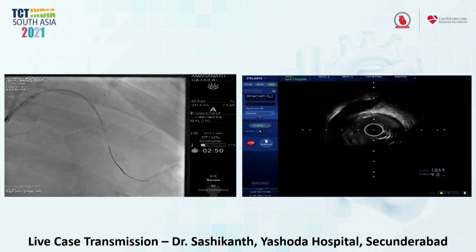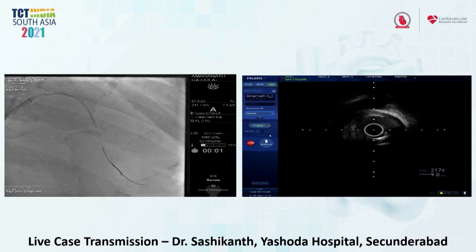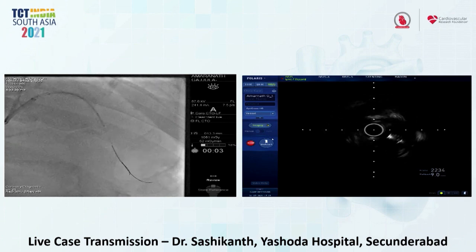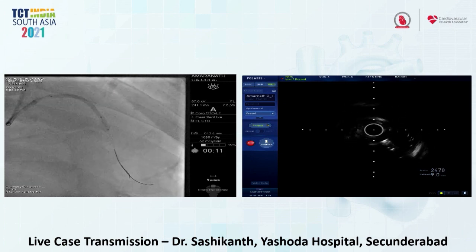The proximal landing zone is quite good, so I would like to inflate the stent here. IVUS catheter. It's okay. It's IVUS and wire should be taken out. No, it's okay. Go ahead. Go ahead. 2, 4, 6, 8. What's nominal pressure? 11. Go to 11. Okay.